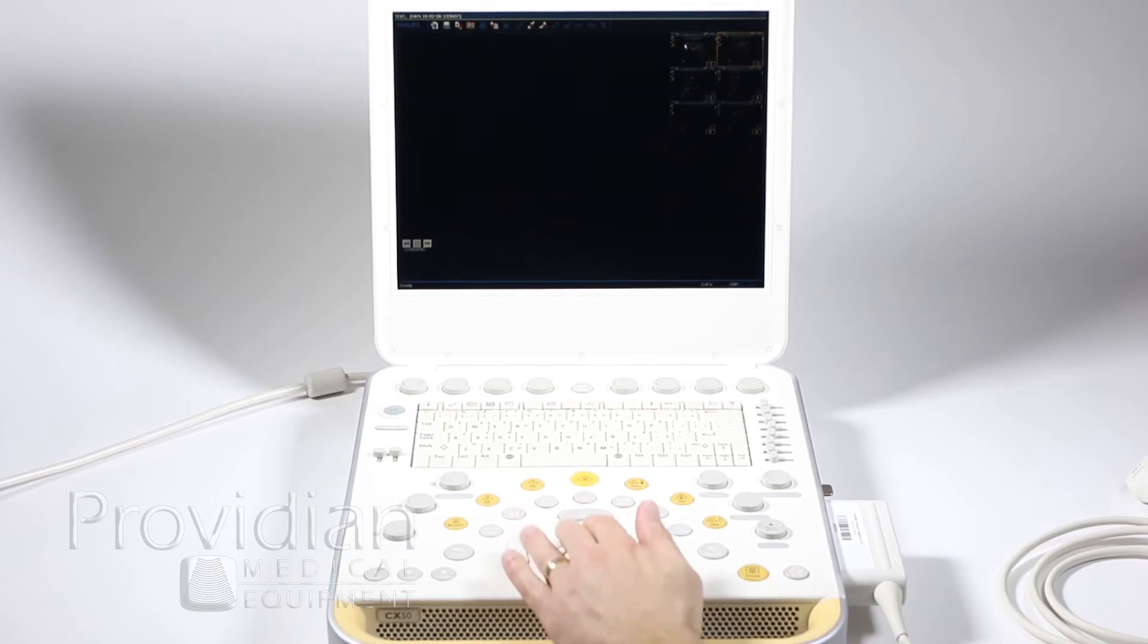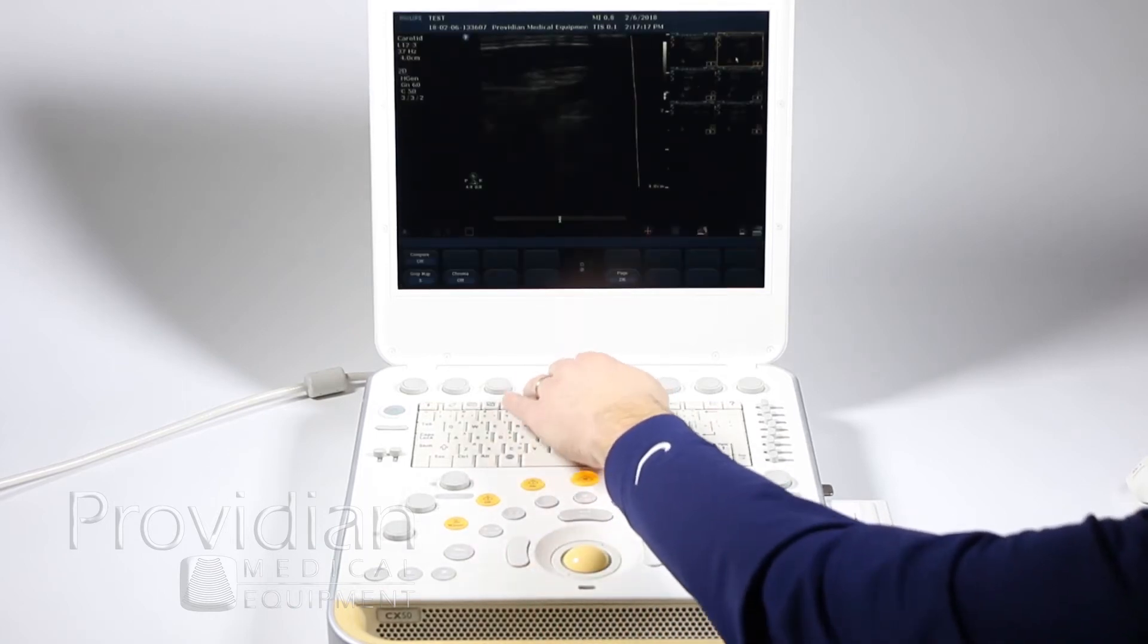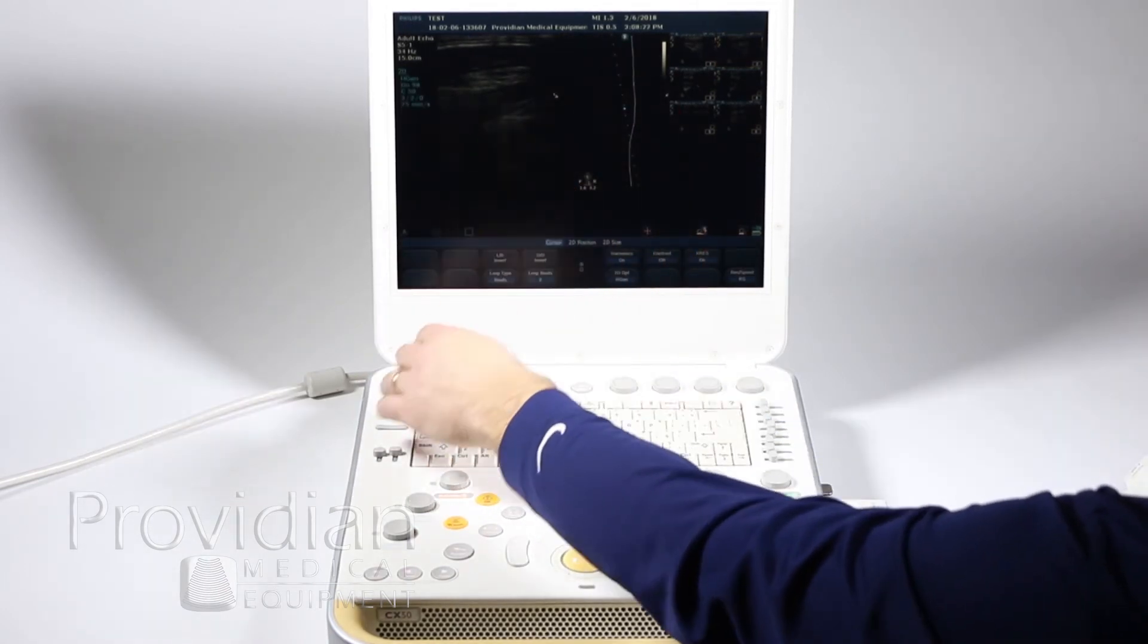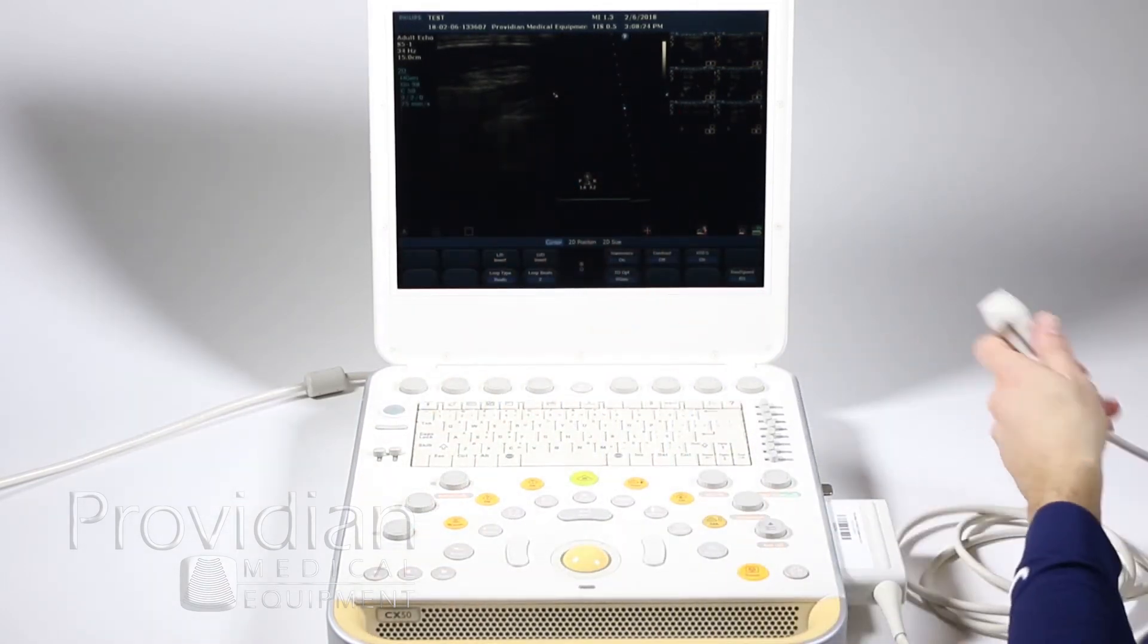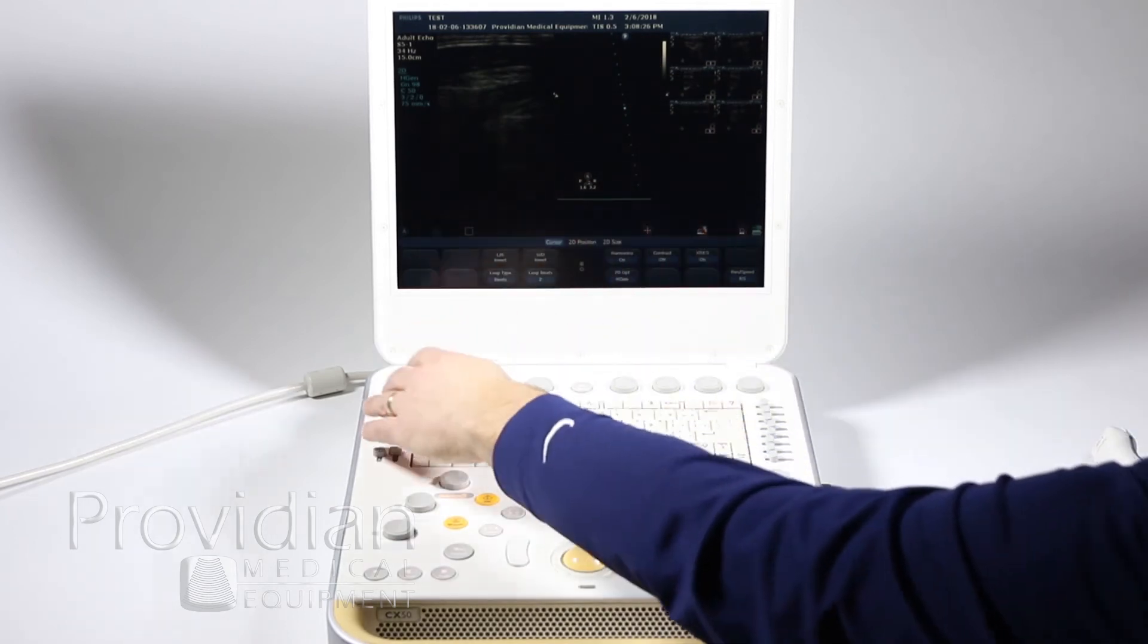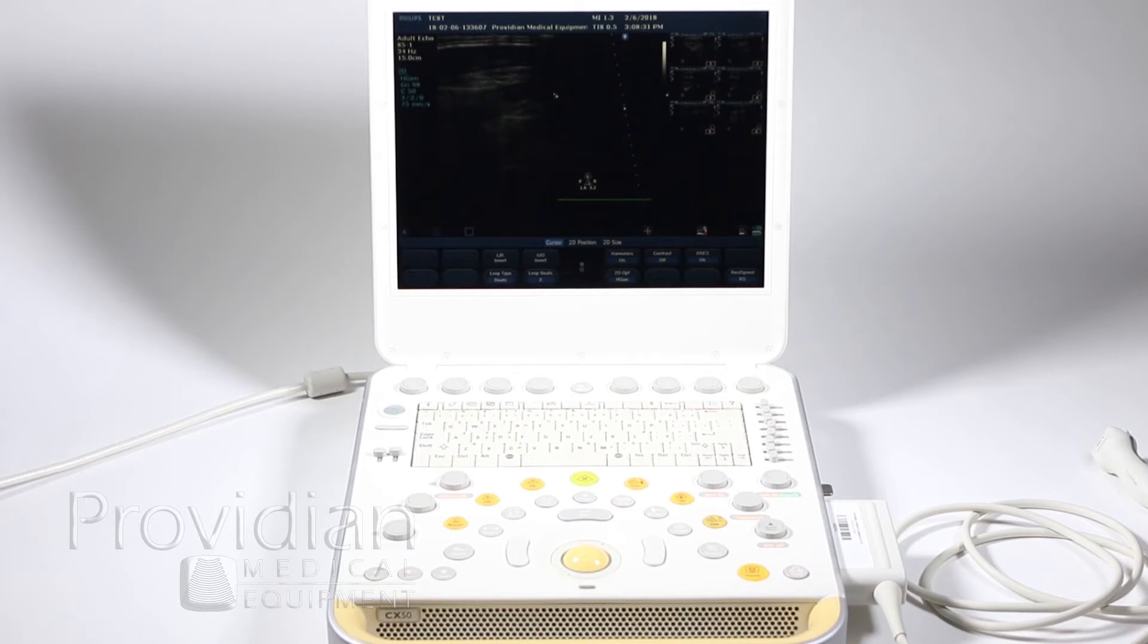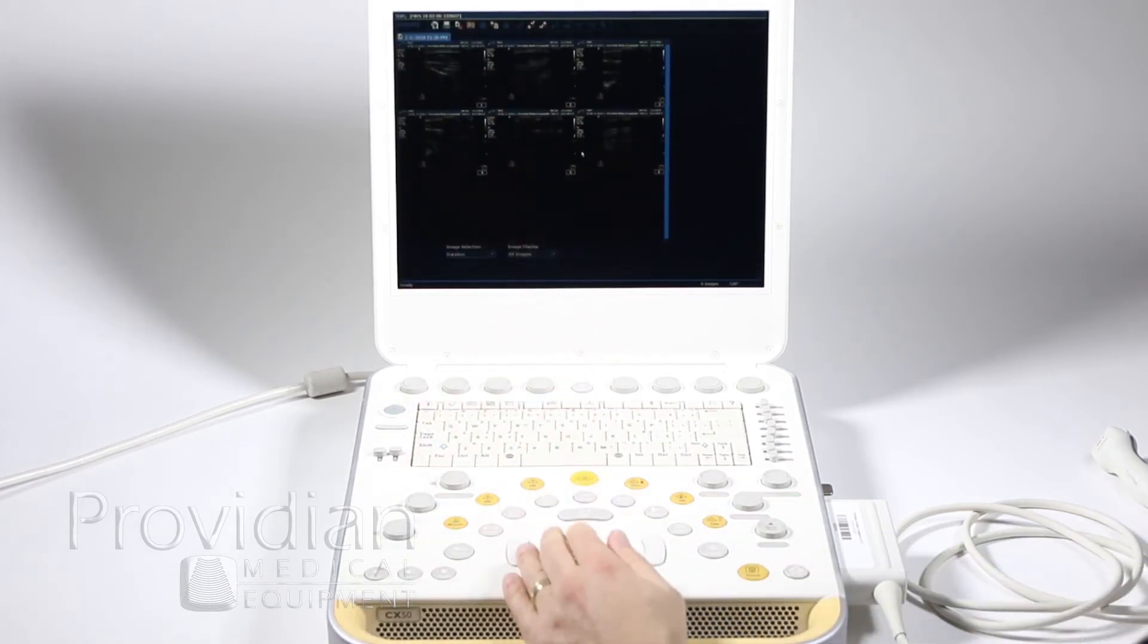And you can select, and even after the image is done—let me go back and deselect this—you can go to the next page and click Compare, and you can see a live image versus what's on there. Right now I have a sector probe so it's actually showing a sector image here, but even after the scanning is done you can go back to the archive and still compare these two images.